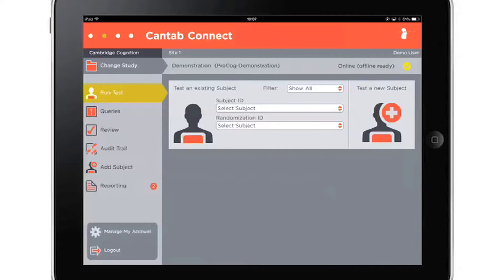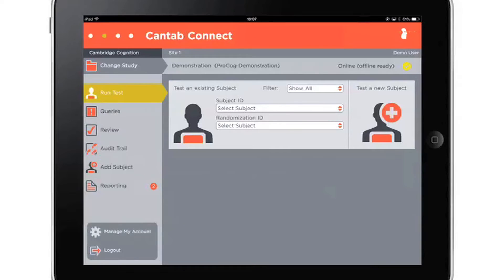The home screen shows whether the device is online or offline. Data can be collected even when your iPad is offline, for example if collecting data out in the field. Cantab Connect only needs to be online in order to access and review data, although it is best to connect to Wi-Fi regularly so that all assessment data is synchronized, ensuring it is as accurate and up-to-date as possible.